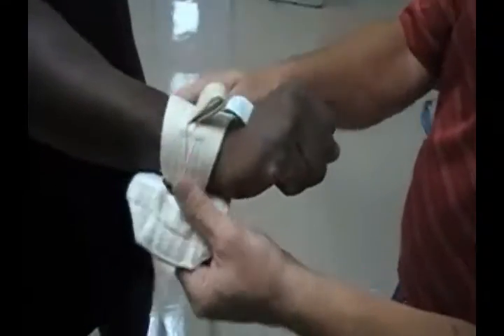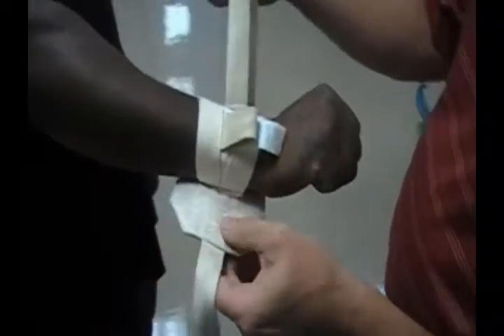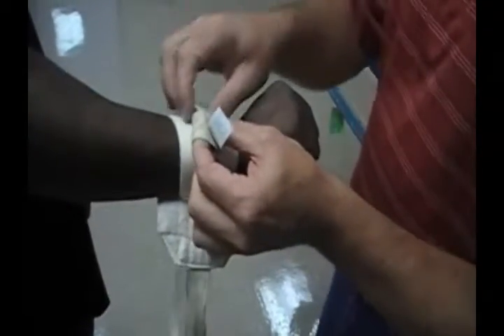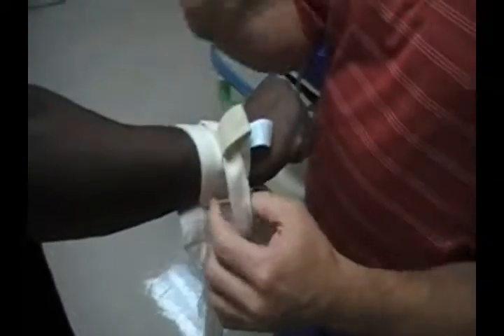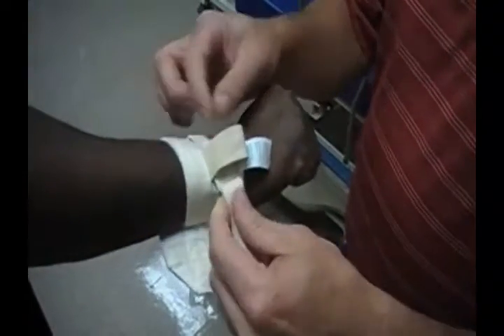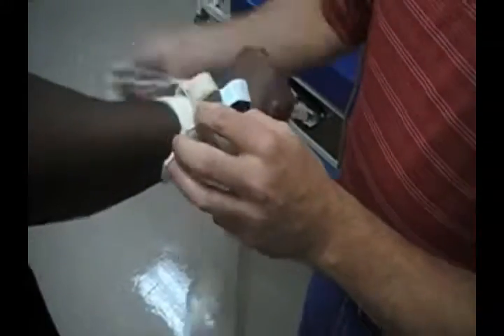Once it's taut, it's on there. You can judge it — you can put your finger through to check. This is the point where you need to make it connect. Then we continue up and loop. You don't want to go all the way to the end trying to thread it through; you most likely won't have time. If you're putting this on somebody, it's not like they're holding their arm out for you. Then I'm going to do the same thing on this side — grab it and put it through the top.